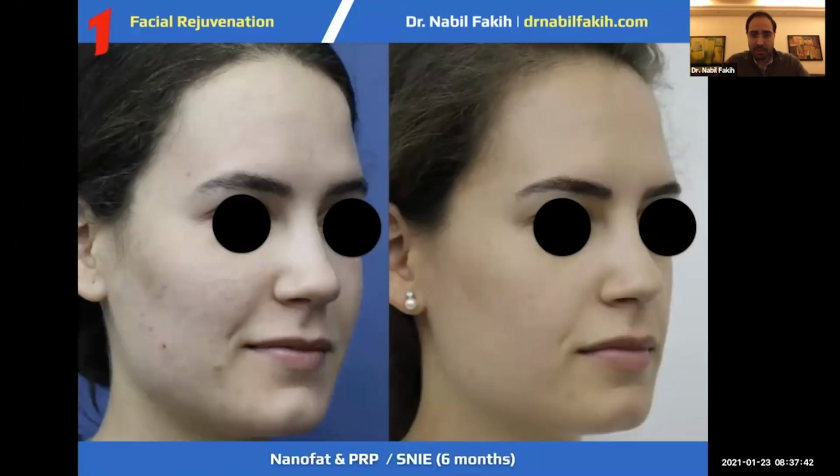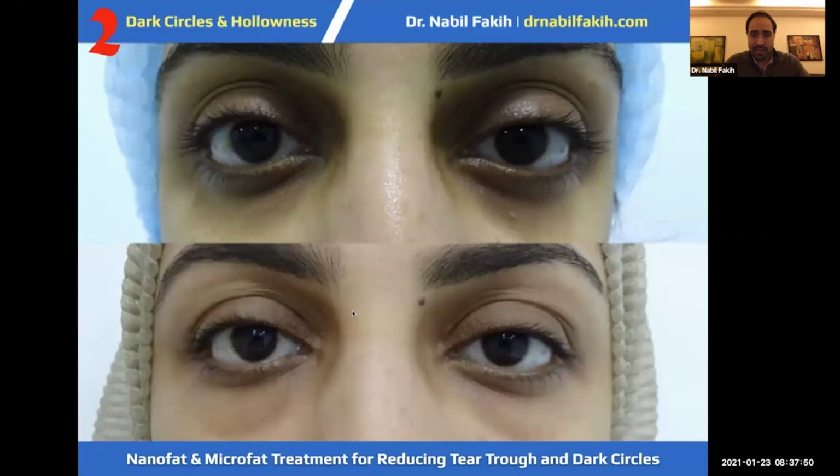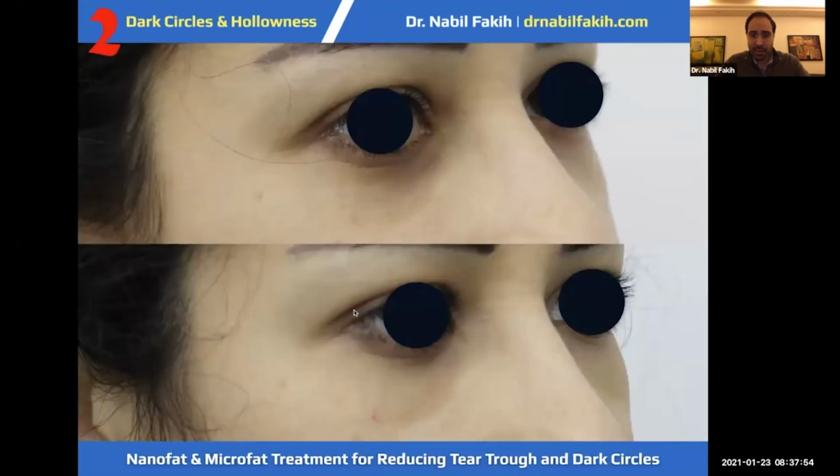And this is another patient for whom I did NanoFat and PRP for her skin. 6 months after the treatment, I did SNIE also for her, for dark circles, reducing the tear trough and dark circles. Sometimes it's very hard to really detect it, but patients are happy after one session. They can report to you that they have seen some improvement. Technically, I can see improvement from here to here.